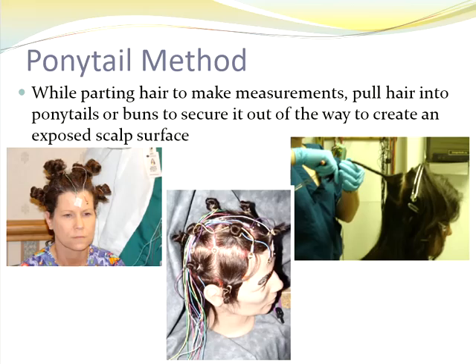And it makes it easier to see where your marks are, because sometimes, depending on how thick the hair is or how dark the hair is, you can start to lose your marks. And so if you get into the habit of bundling your hair precisely, you won't ever lose where you made your marks.